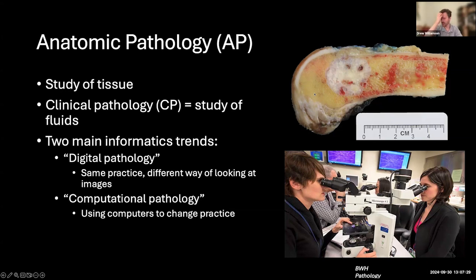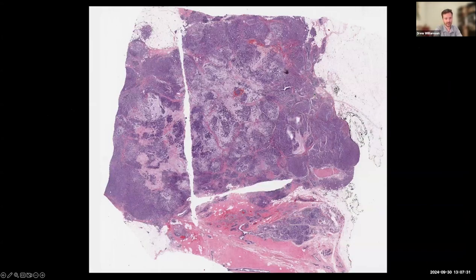Here's an example of a breast cancer slide from the TCGA, which is a big publicly available data set of pathology images. Pathologists might look at a slide like this at this magnification, where we've stained it with hematoxylin and eosin, which turns the tissue a combination of blue, pink, and purple. We might see a lot of purple stuff here that's probably indicative of a tumor.